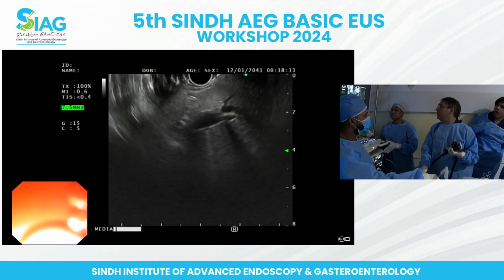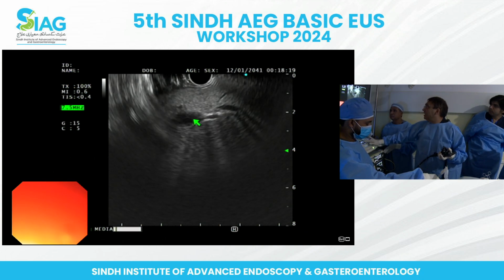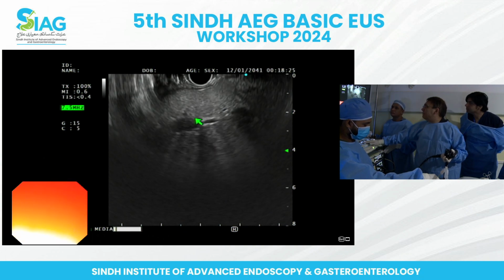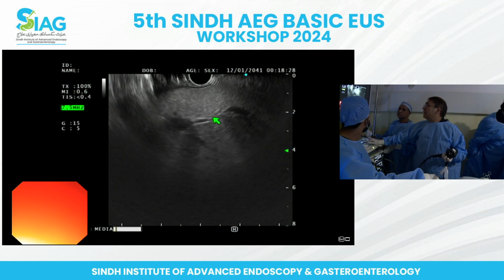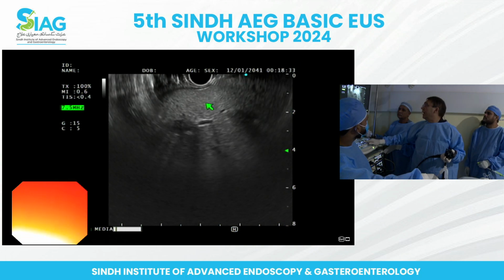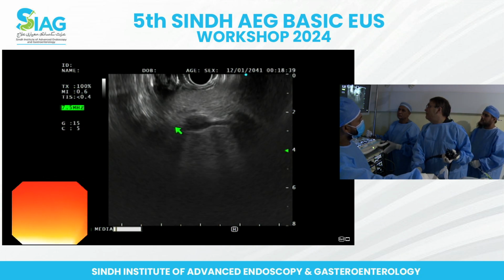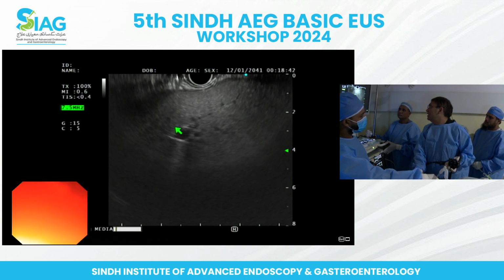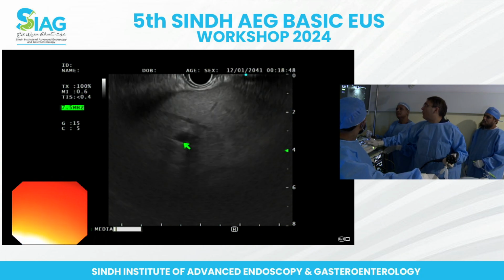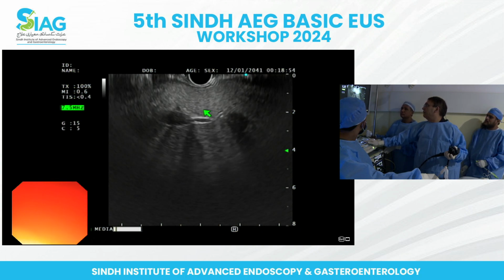This big vessel is the left portal vein, okay? And this left portal vein right here has this white band. You see this white band? This is the ligamentum venosum, and the segment above that is the caudate lobe, okay? And if I push a little bit in, I may be able to see the ligamentum teres. It's a little bit difficult again because of the fatty liver, but this is the ligamentum teres right here. So the caudate lobe was above that.